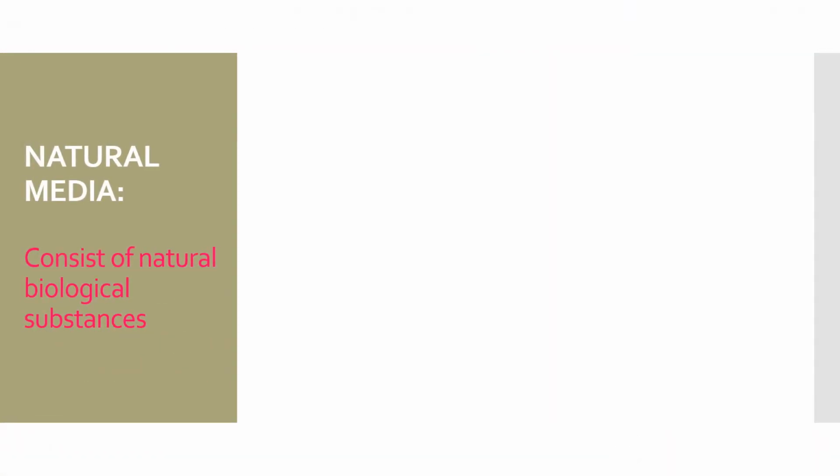Natural media. These are media containing naturally occurring ingredients. In spite of a vast use of chemically defined media in animal tissue culture, it is still necessary in most culture undertakings to depend on naturally occurring substances.